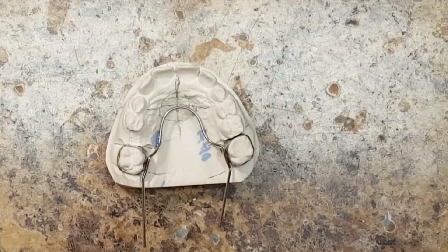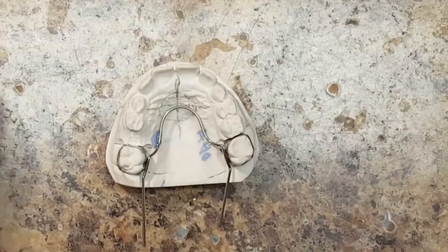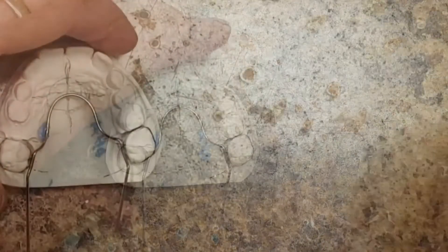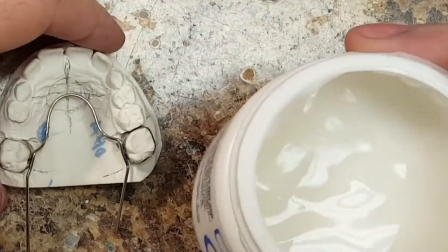Hi, this is Steve Zara from Zara Dunn Lab, and you are watching part two of the series for Nance buttons. In this video I'm going to demonstrate how I solder the Nance button.